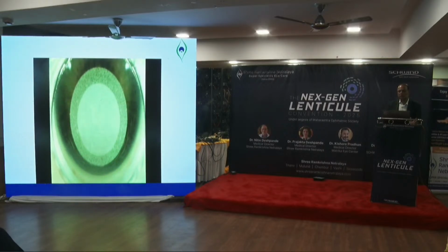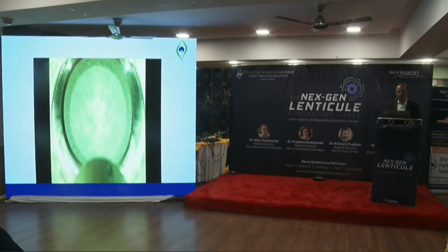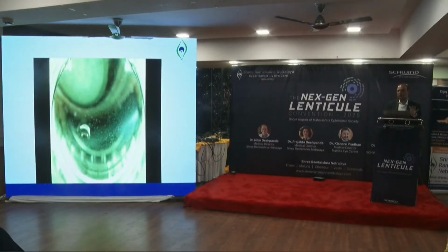The advantage of this cut is you don't get black spots in the center, because as patients become a little anxious by the end, the black spots won't be there in the center, which is a very important zone. And then you can see the entry cut is done. So the whole process is pretty quick. The machine has a good amount of vacuum, so we have not had any suction losses till date, which are problems with some other platforms. So it's a very safe procedure with this.